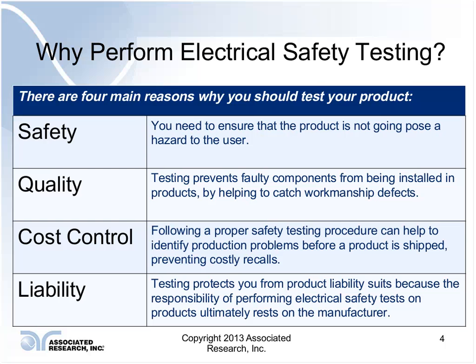And then liability is probably, of course, one of the big ones, because really the bottom line is the safety testing rests on the manufacturer. If you get audited and they find out you hadn't been doing your safety testing, it's going to be a big problem for you, because it's up to you, the manufacturer, to make sure that your product is properly tested before it goes out onto the market.